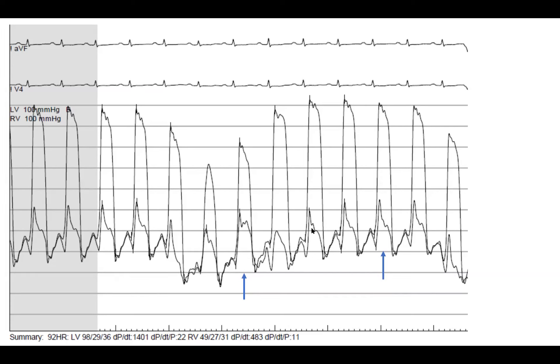So you do have systolic discordance — actually pronounced discordance. Even some doctors who looked at this case thought it was concordant, not just fellows. So be careful: you have to look at the pulse volume. This patient has prominent systolic discordance, and he did have constrictive pericarditis.